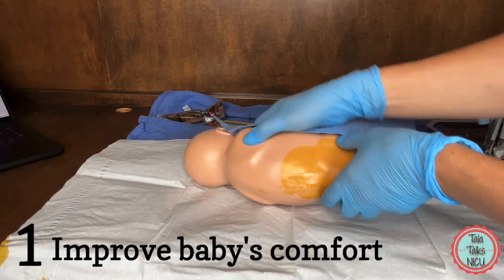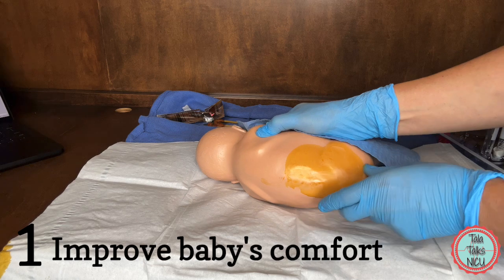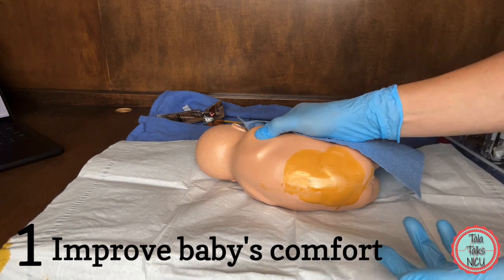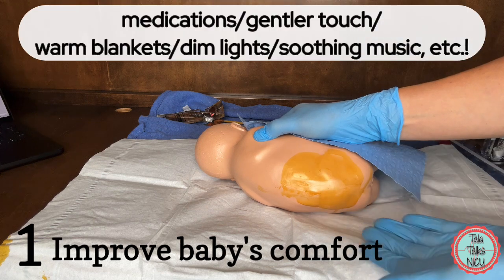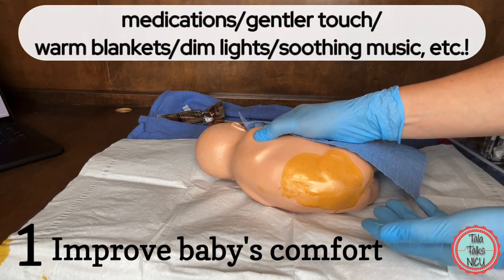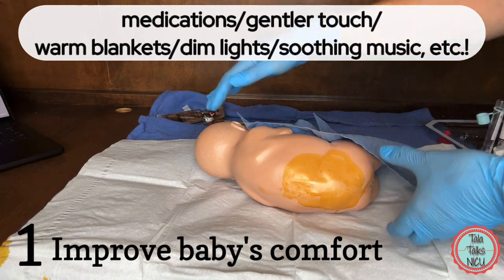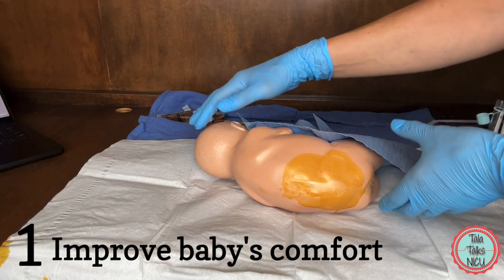Number one: the baby is fighting you too much and clenching up, and there's no gap between the spinous processes. So what you do is make the baby more comfortable, whether that's with medications or non-pharmacological methods, so that there is a way that you can actually hold the baby better.